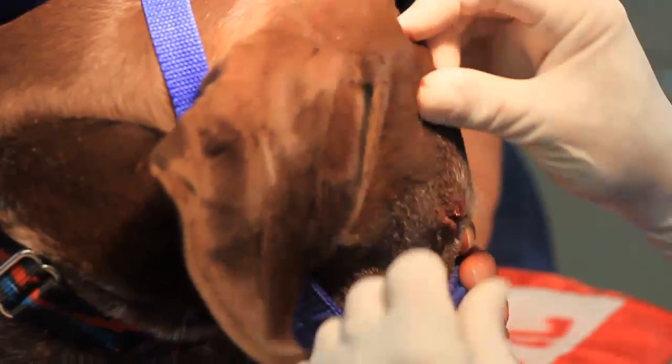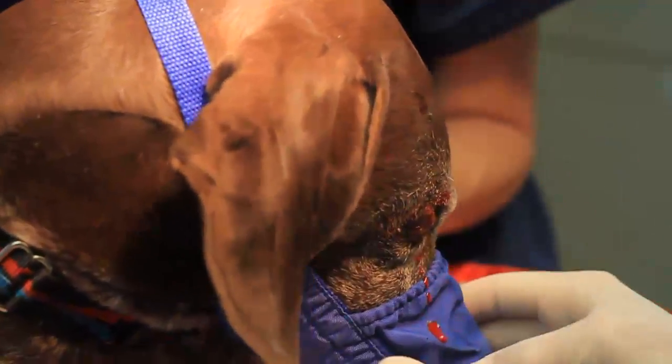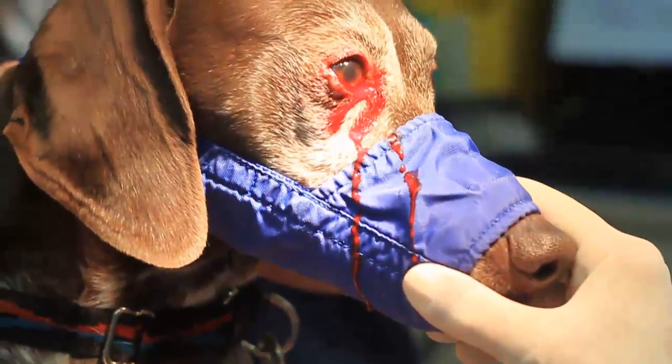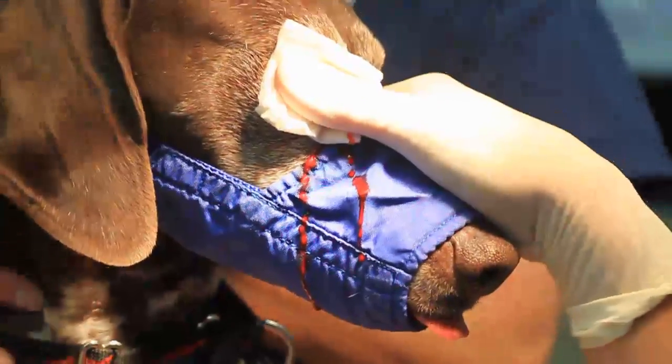Now we'll take it off and you're going to see this thing is going to bleed — it would just scare people if you sent their dog home with this bleeding. So we'll just put a 2x2 on there and put a little pressure on it for a little bit and allow it to stop. That's it.